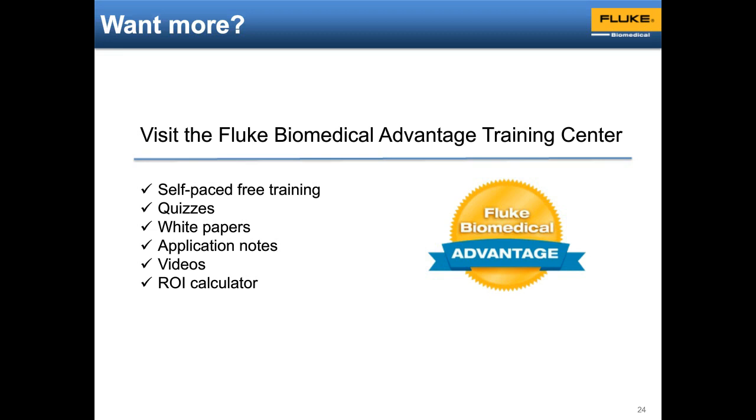Great, and the readers tend to have a lot of questions about R curves, associated with the monitors or probe when the manufacturer of the monitor uses other probes. I know you kind of covered that, but can you talk about that more in depth? Yeah, sure. So the R curve is developed by the manufacturers during the development process, and they have to do a clinical study, usually what's called a breathe-down study, where a patient is actually deprived of oxygen and their blood gases are measured during that.